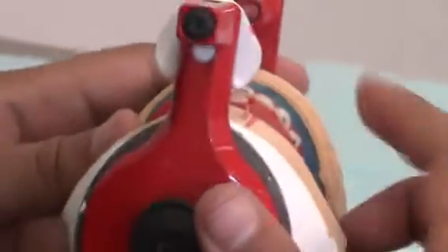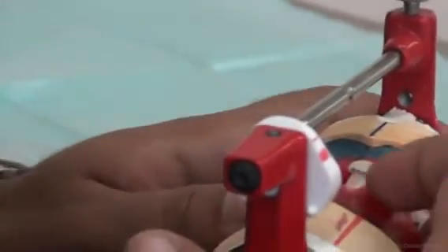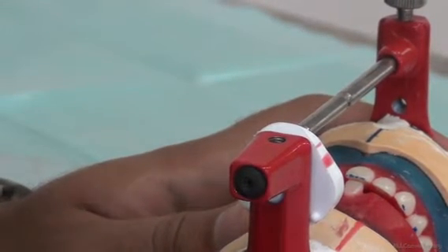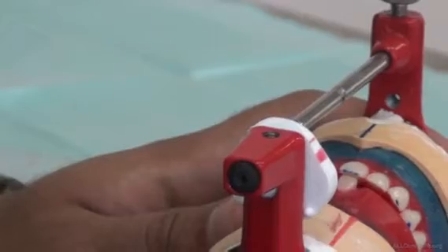Okay, what are we comparing here? We're comparing the position of the tooth to create what we call an overjet. You can see clearly that the lower tooth is going upwards more than the incisal edge. It's coming into close contact with the upper, but not actually touching. There should be a space. There is an overjet, there is an overbite, but there is a very minor space in between the two teeth. The lower should not be touching the upper. We'll try to focus on it and show you the overbite.